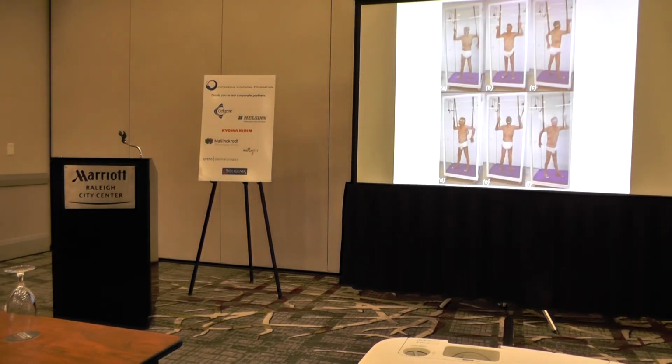Now, I try not to include any patients that I've treated that live anywhere near here in this presentation. So I had to find some pictures from the internet. So this is a picture of total skin electron beam therapy in like Moldova or something. So this is not how we do it, but it gives you a sense of how it works.